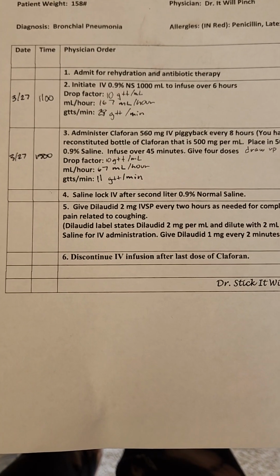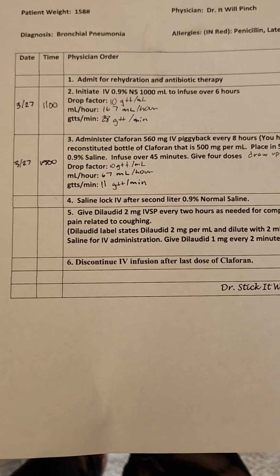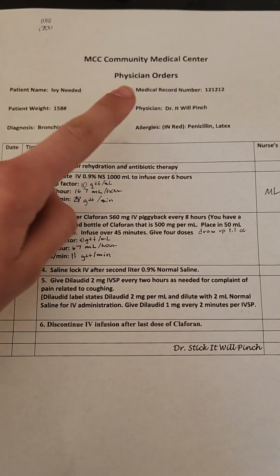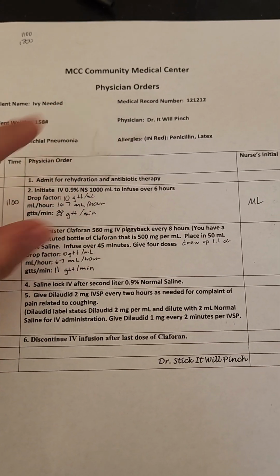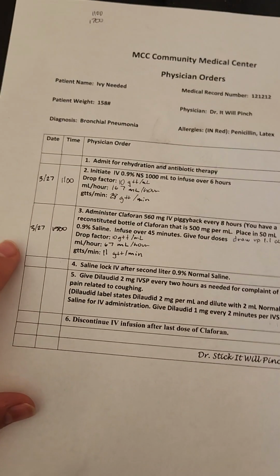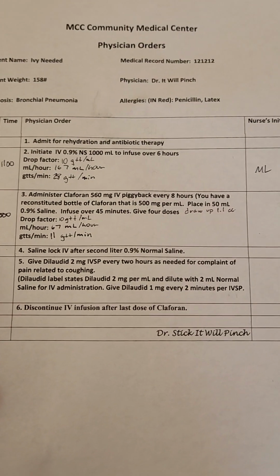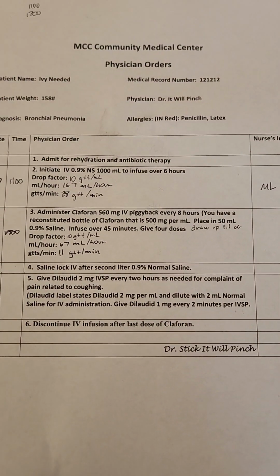There it is on my MAR, and so when I'm looking at my MAR, I'm going to confirm that this is my patient. This is her medical record number, that it's the correct date and time to be administered, and I'm going to look at any of her allergies.